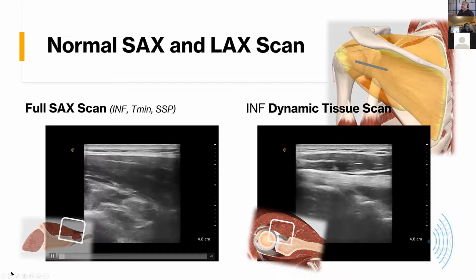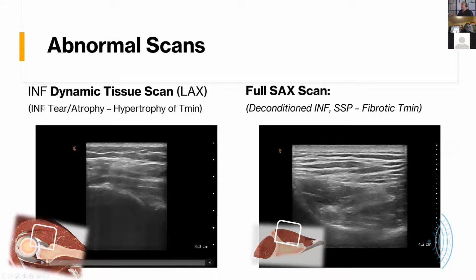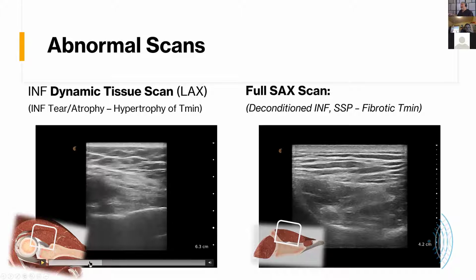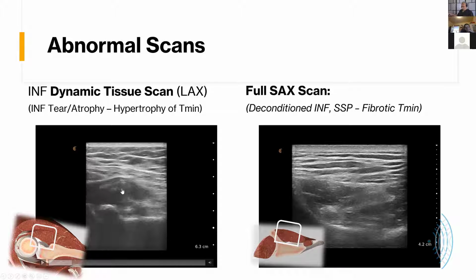What you remembered before, which is that long tendon of the infraspinatus, I want you to be aware of. This is a patient whose tendon is torn. So we again have the head of the humerus. We have where the tendon should be in its entirety, and I'm going to go ahead and hit play on this one. You're going to see I'm asking her to internally and externally rotate that muscle, but this big wad, this big area under the screen right here, like a snake in a bag, is a wound up infraspinatus tendon.